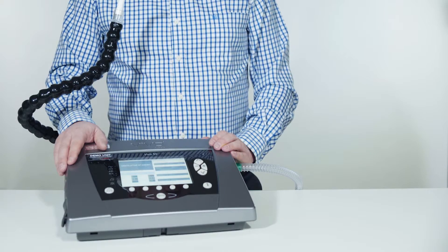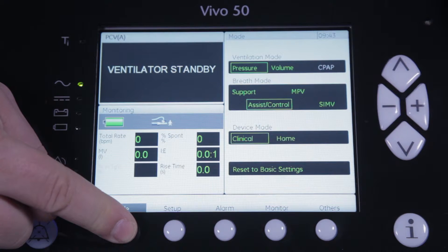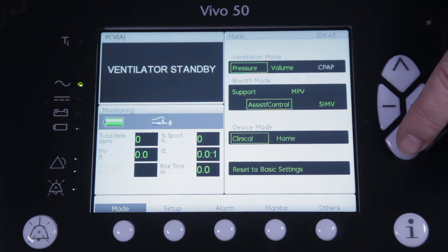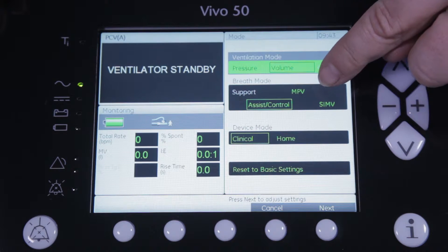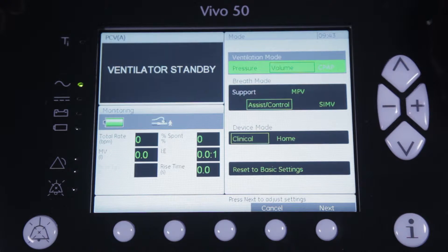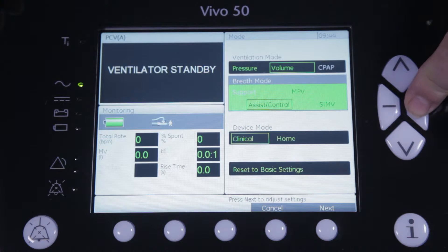To start we go to the mode section of the ventilator and select volume as our ventilation mode. As you can see, MPV has now been added as a dedicated mode, so you just have to highlight and select it to start the configuration.